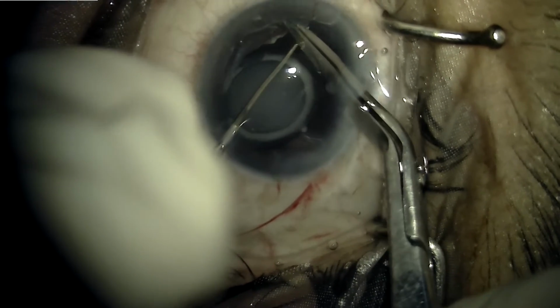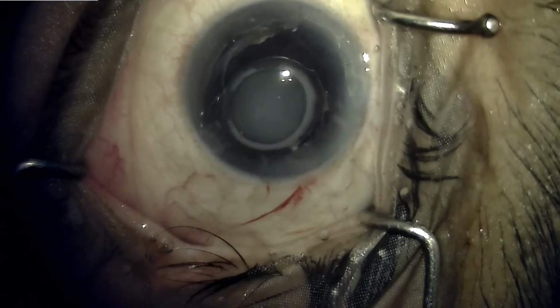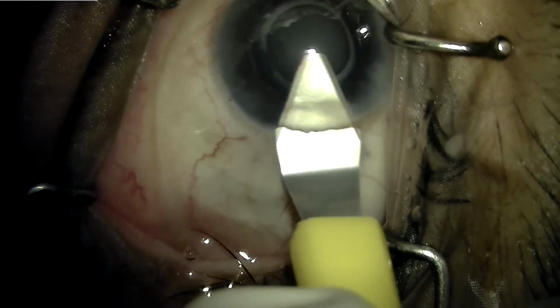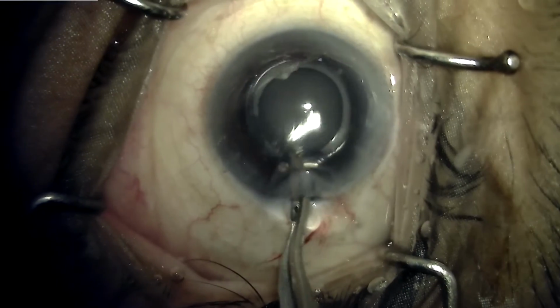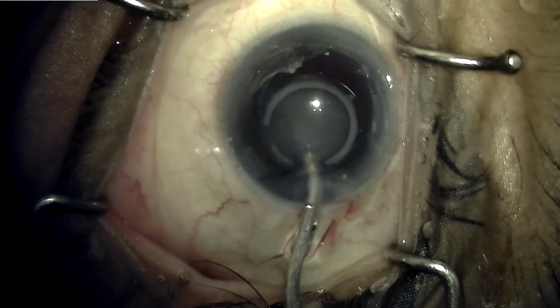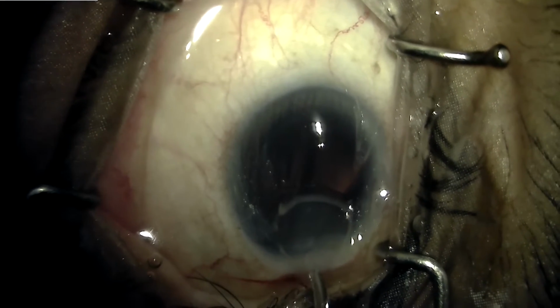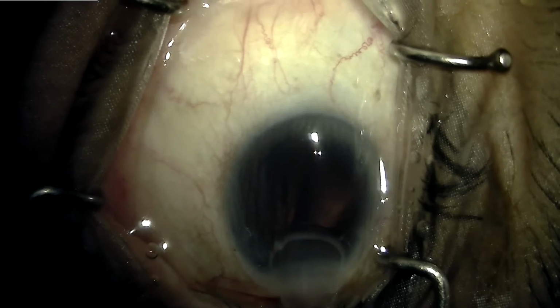Care was taken not to damage any part of the remaining capsule so that we could implant a PCIOL in the sulcus. Because this IOL couldn't be twisted, it was calcified and very hard, so we had to enlarge the incision, and holding the optics which had been detached from the haptics, we were able to explant it using a 5.1 mm incision. It was a tight fit, but the IOL came out by that incision.